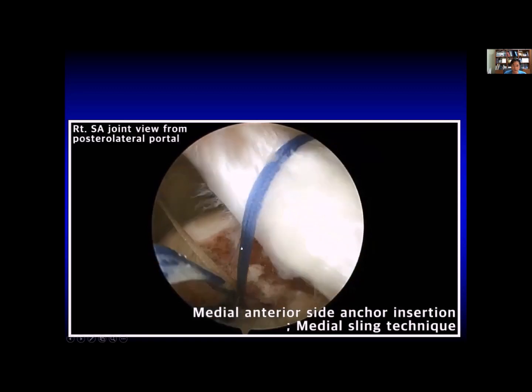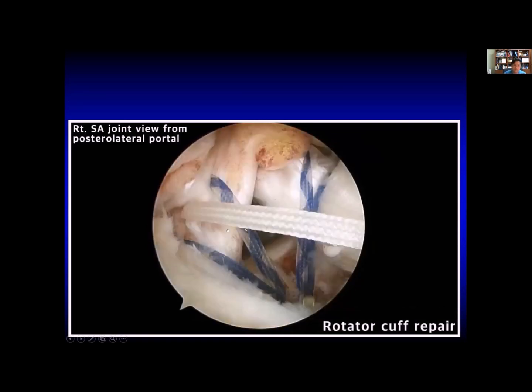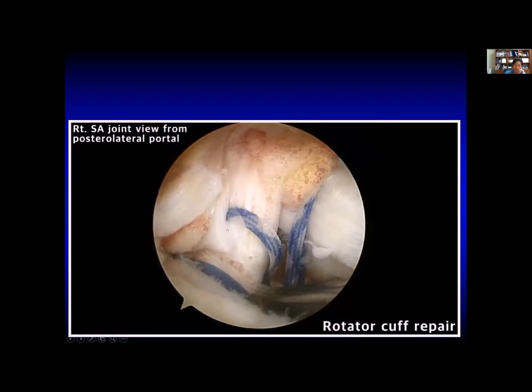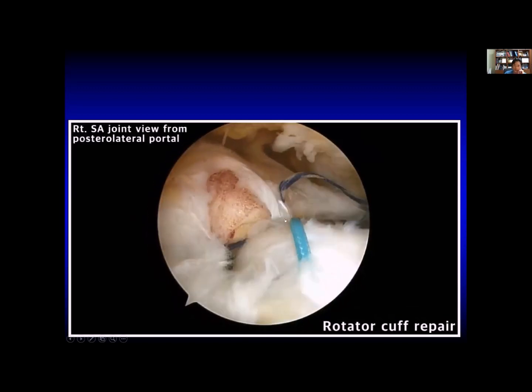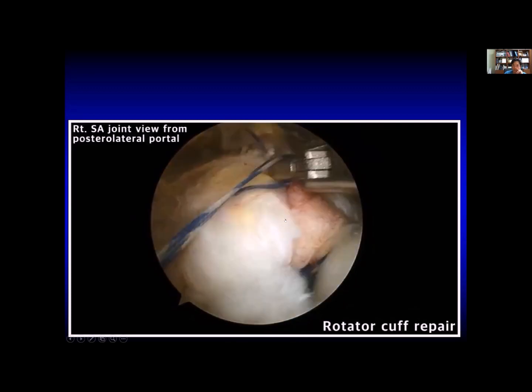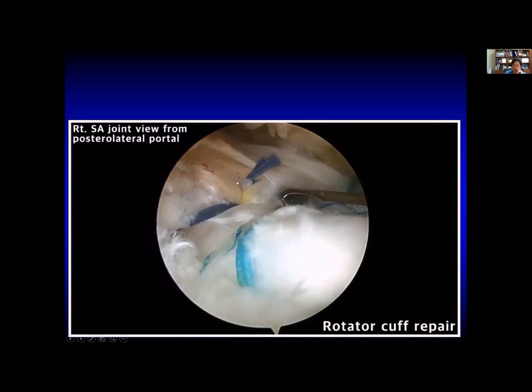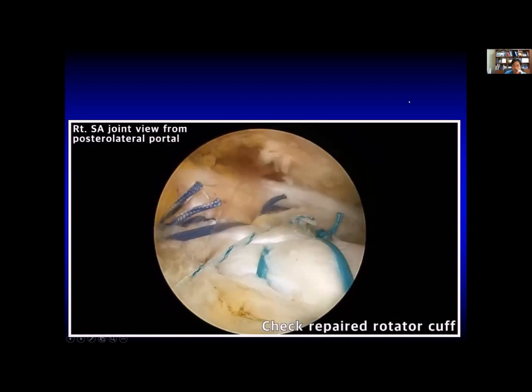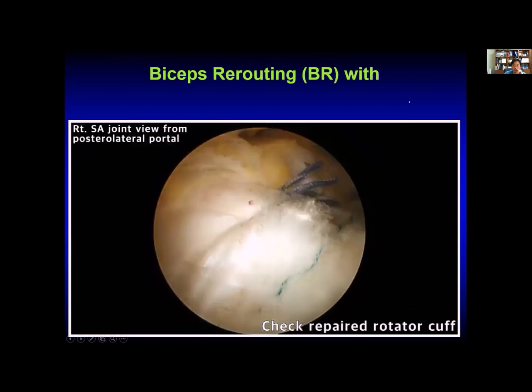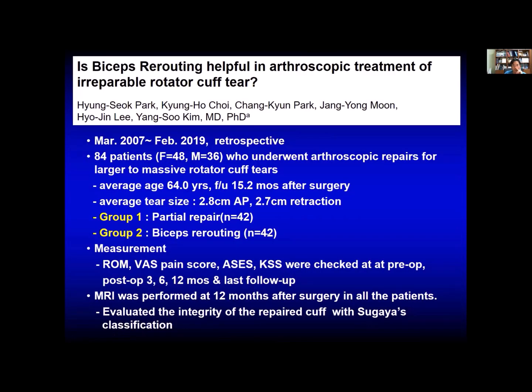This prevents lift off of the bone. And then repair the torn cuff tendon like this. So this is a recently modified technique, the biceps rerouting. This is the biceps and cuff repair like this. Okay, so this is the rerouting medial sling technique.